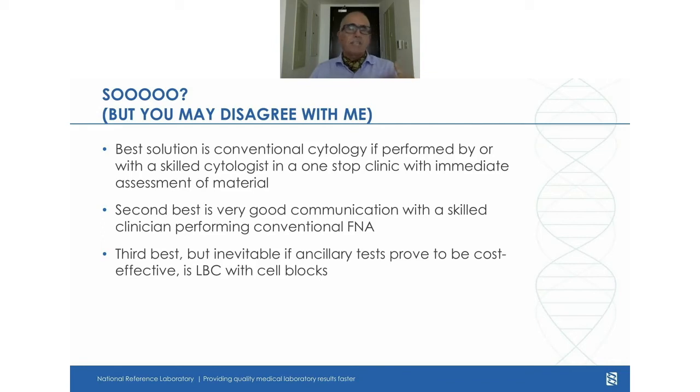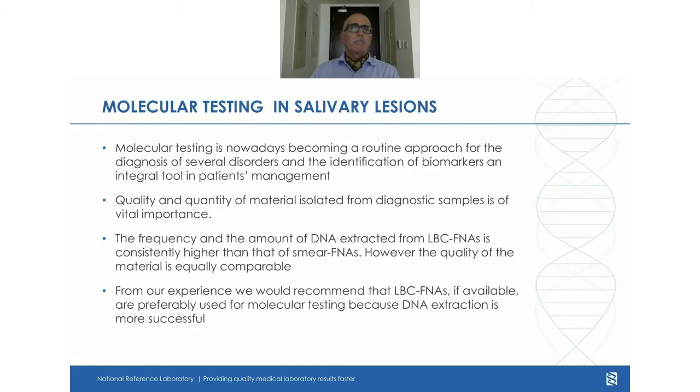You just aspirate and put everything in a liquid vial, possibly splitting between a liquid vial with a fixative and saline or RPMI, depending on how far you are from the lab. But I would encourage everyone to communicate with the cytopathologist, and we are ready to answer all your queries so as to optimize the material.